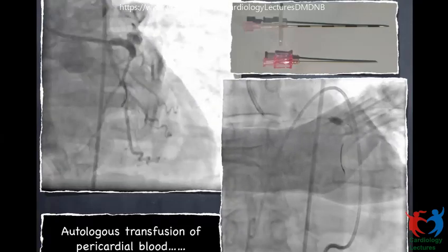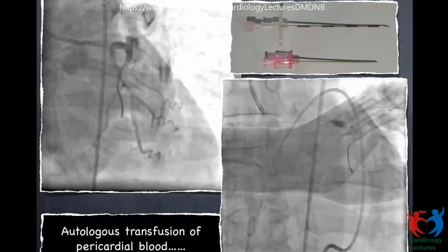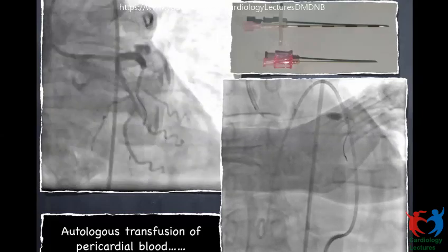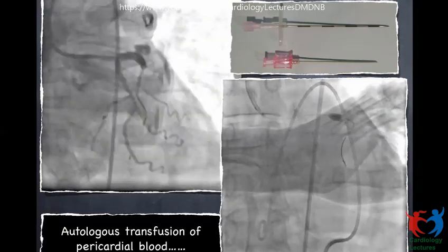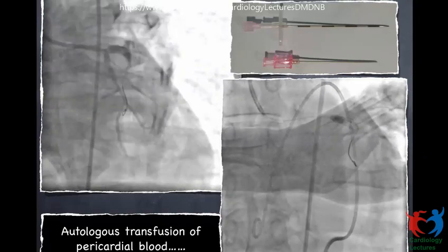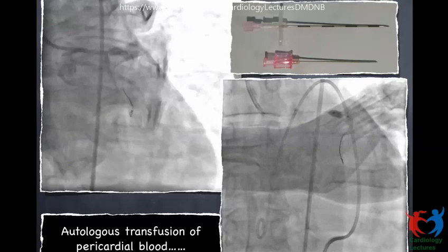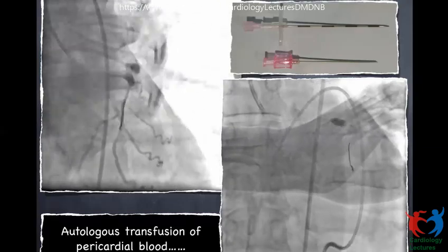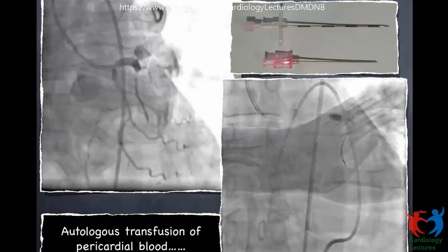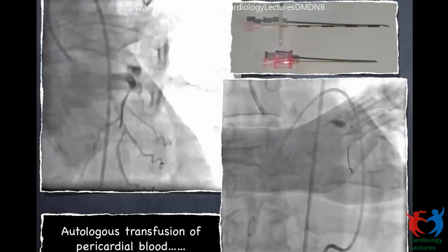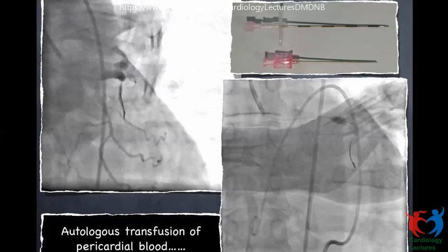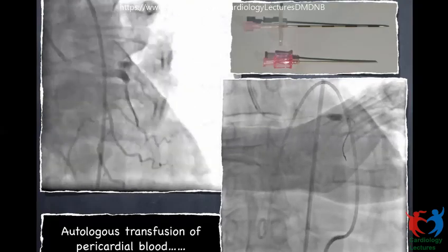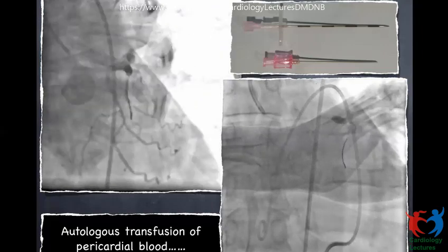The next step was to remove blood from the pericardium. You could see two needles: one is the regular femoral puncture needle, and the upper longer one is the epidural puncture needle — a better option for pericardial access. The first step: inflate the balloon, disengage the guide catheter, partly reverse the heparin effect, and relieve the tamponade by placing a pigtail catheter inside the pericardium.